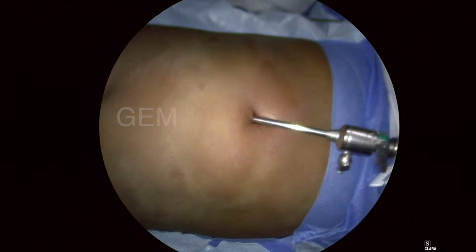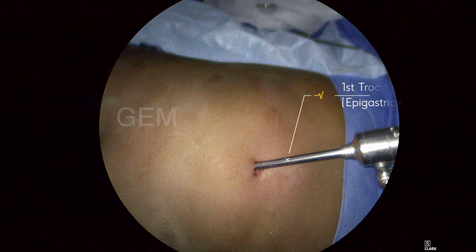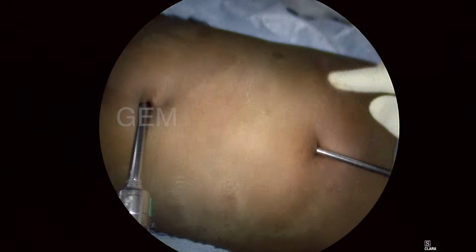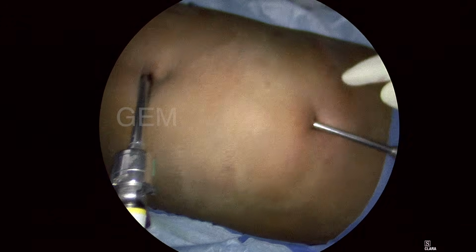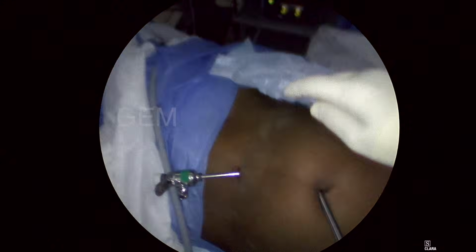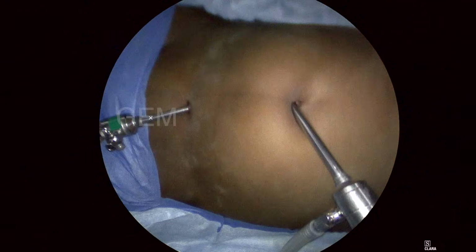There is a mass-like feel and localized guarding. So that's why I put the first trocar as the epigastric trocar, which is a relatively free area. I don't want to put it in the mass area. So I made this trocar just below the costal margin in the midline. Under vision I made the umbilical and suprapubic trocars.